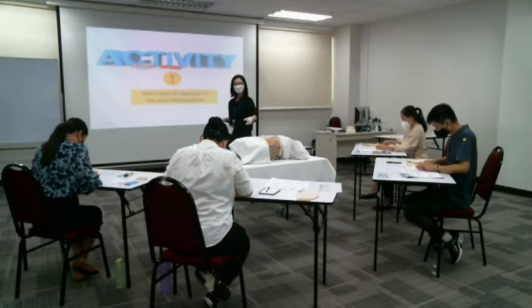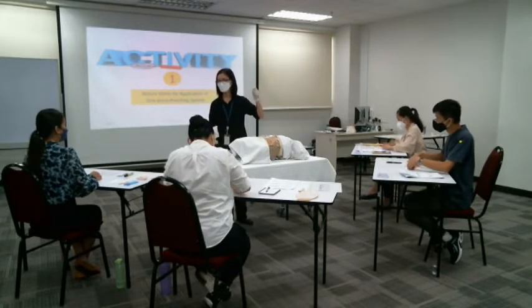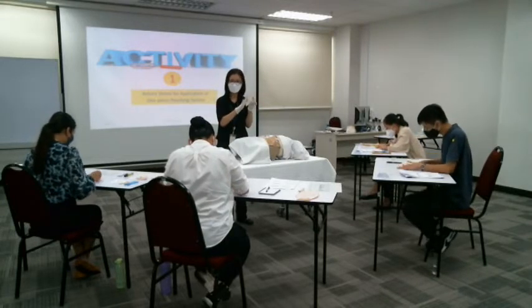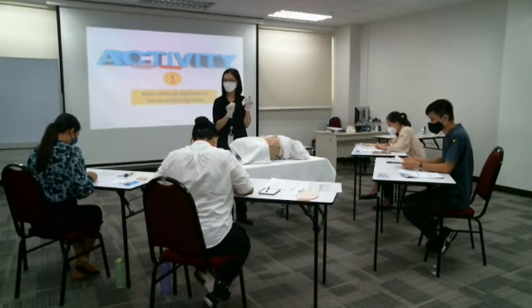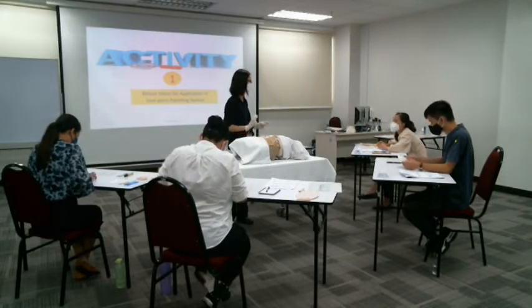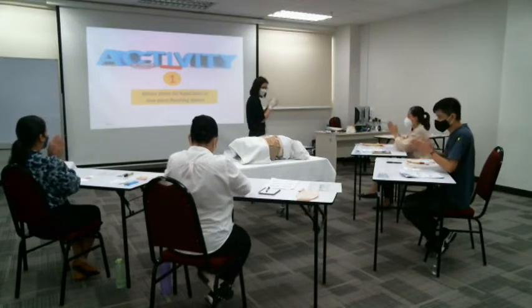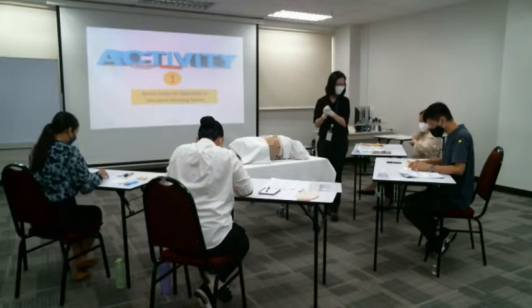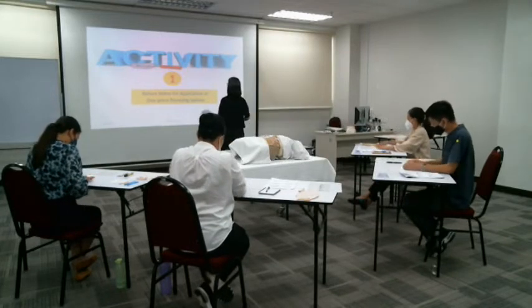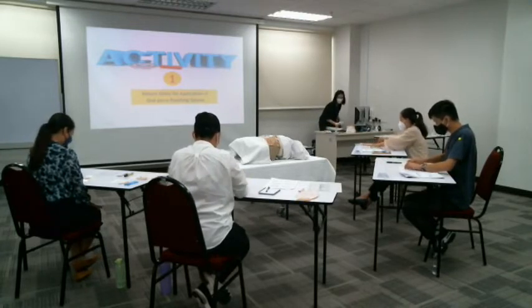So this disposable one-piece system comes with the backing paper. When you remove, you have to remove the whole thing. Some of it got two parts, as you see in the video. So if it is two parts, it's easier for you to settle one side first, and then after that, settle another side. You do not want to have wrinkles on this adhesive plate when you are putting on it. Okay? Everybody done? Good. This is about the one-piece pouching system. Next.